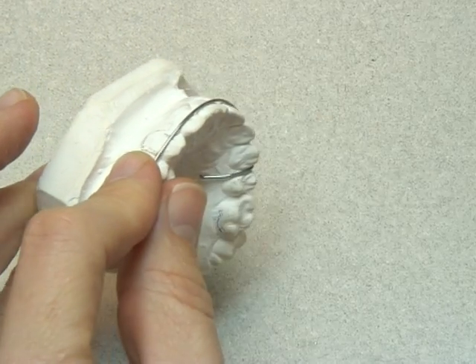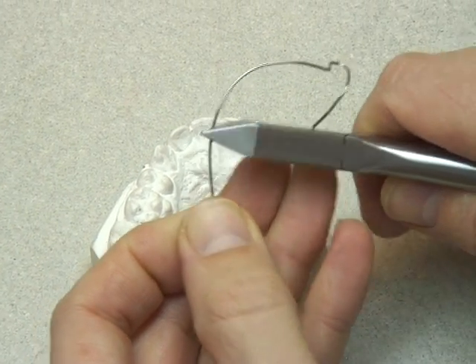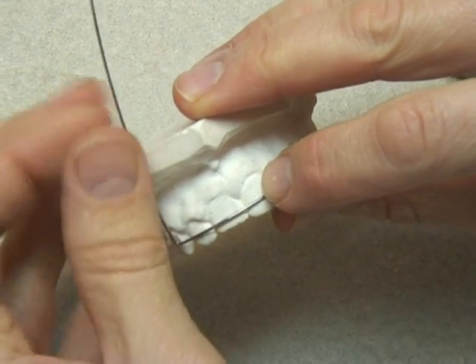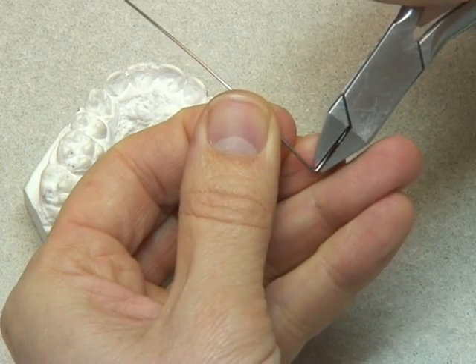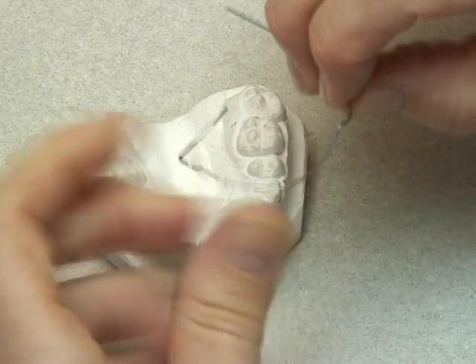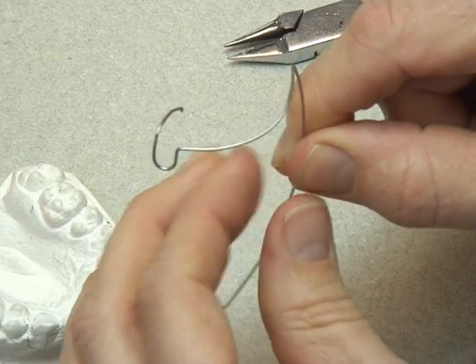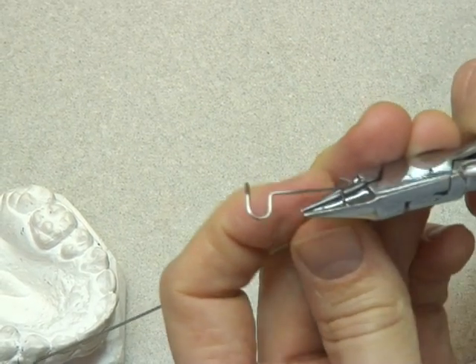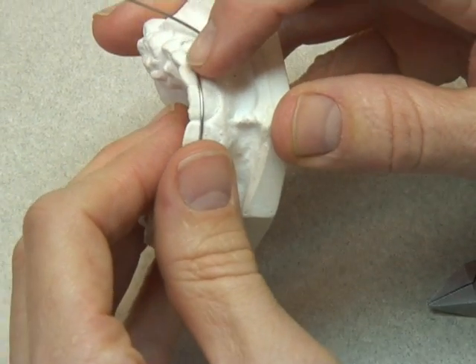Once we're happy with one side, we turn it around, mark off the same point on the opposing canine, and make a 90-degree bend from the labial bow. Again, we won't be able to fit this on the model because it's going to hit the land. Then we take our spring-forming pliers and start to form the loop — I just made that 90-degree bend a little bit acute, so I was straightening that out first. Again, imagine where the U-loop is going to be relative to the teeth, position it back on the model, and start the U-loop. We bend half of the U-loop, which enables us to try it on and make any adjustments in length, direction, or size without having to start again.